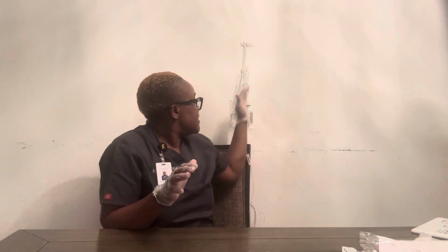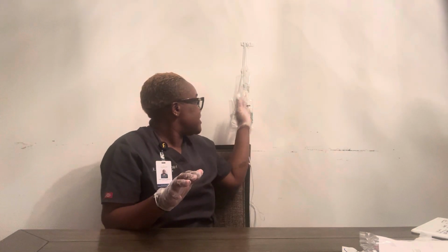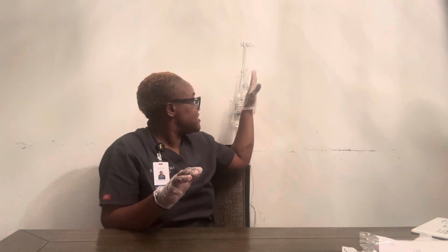I'm gonna gather my supplies, and before I leave, I have to make sure that both bags are hanging, both the fluid and the medication. I have to ensure that both of them are hanging at least 30 inches above the patient's IV site. So now that everything is okay, I have gathered my supplies. I'm gonna remove my gloves, perform my hand hygiene, and I'll go document my procedure.